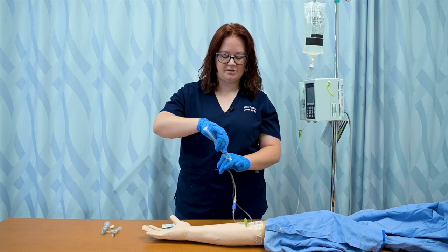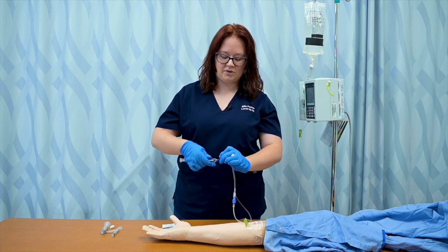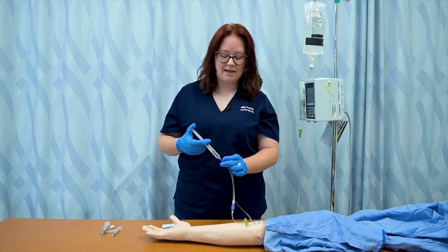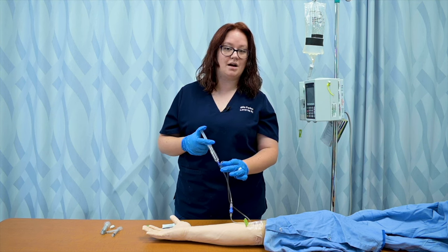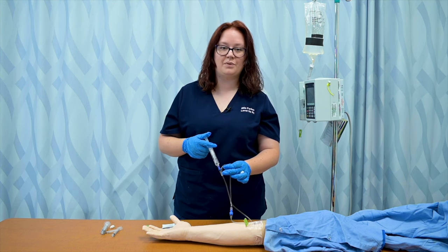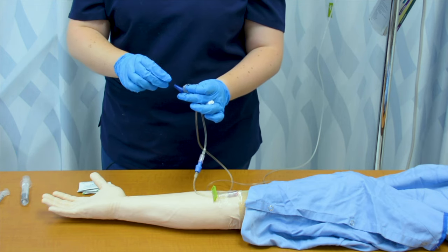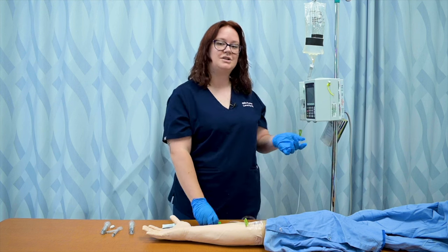And I'll need one more flush. So this flush is to make sure that the medication is out of that part of the tubing so that it is A, administered at the correct rate. So I'll be pushing this 3 to 5 milliliters at the same rate that I pushed the medication. And B, if I don't put normal saline right here and flush, the medication is going to come into contact with whatever's running through my primary line. And so if that is incompatible in any way, I wouldn't want them touching each other. So I go ahead and flush that through. And once I've completed that, I would return a new disinfectant cap if my facility follows that policy, make sure I unclamp or unkink my tubing, and just restart my pump.